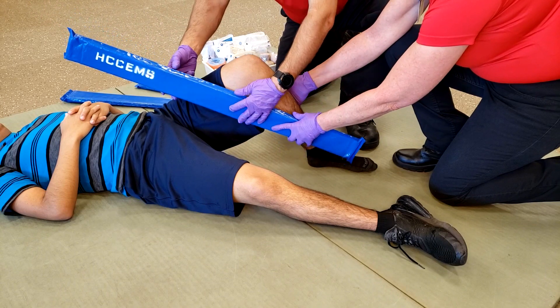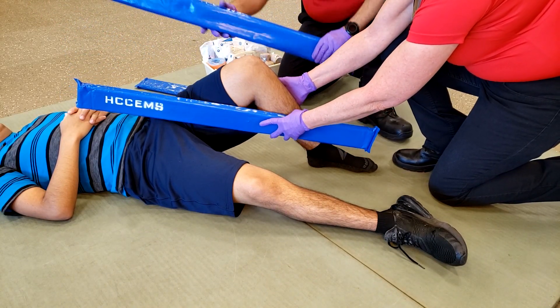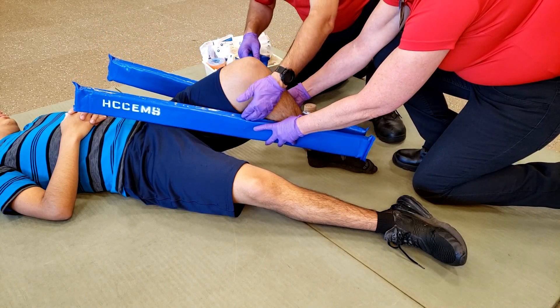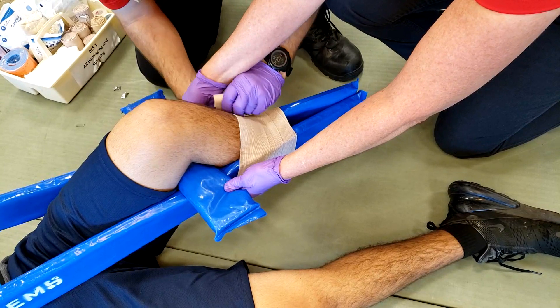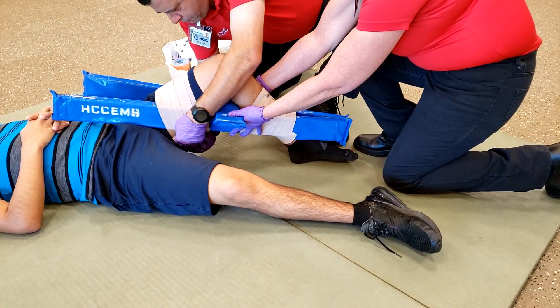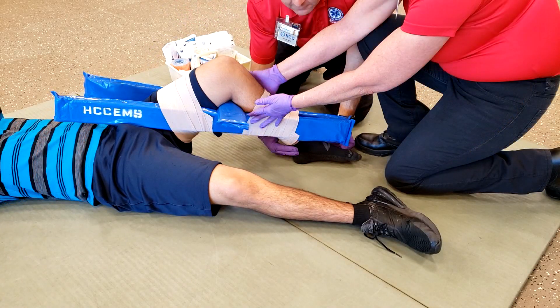Maintain the injured area stabilized manually while the long boards are placed on the medial and lateral side of the knee. Notice that a third and shorter board is placed under the knee for extra support. Secure the splint distal to the injury, and then proximal to the injury.